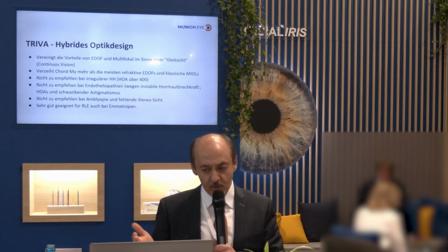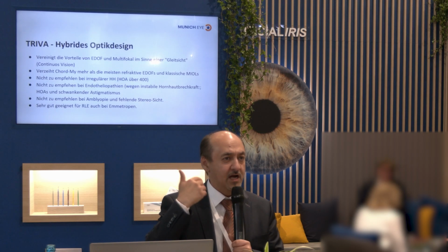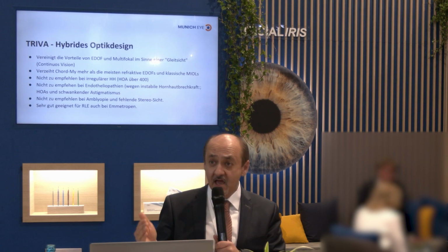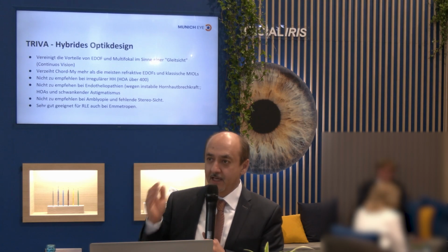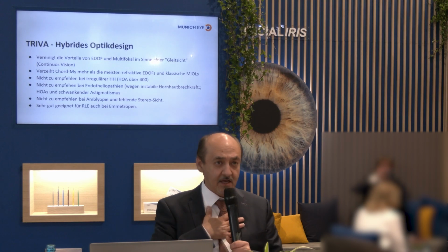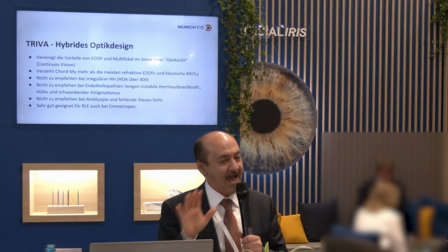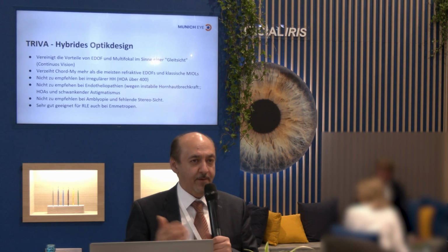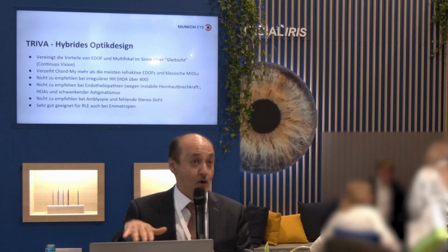It is not recommended for amblyopia and lack of stereo vision, because they have several isofocal foci. They have to process that. The brain has to learn it. After a year, they're okay. But the question is, do you want to listen to a year that it's not okay? That's the question. That's why, due to my very short patience, I don't do multifocal lenses for this patient with amblyopia. That's your patience. Dependent. If you can manage it, listen to it for a year, you can do it. After a year, he's also satisfied.